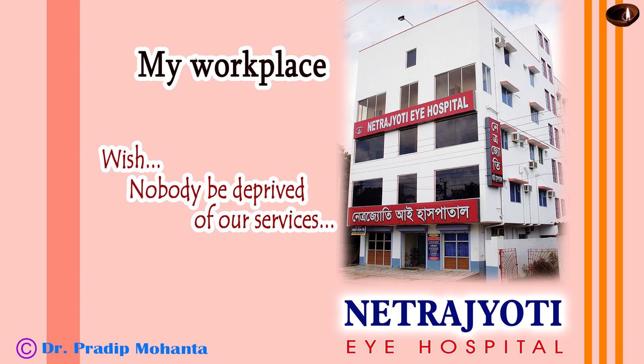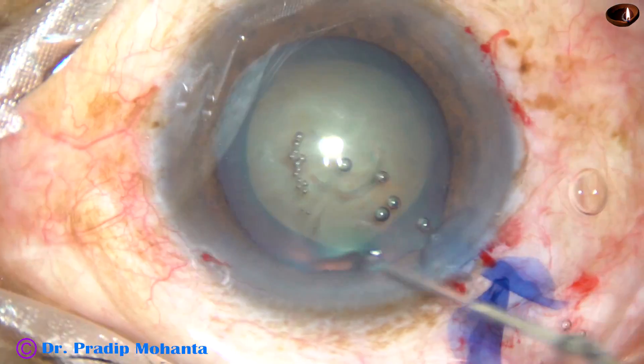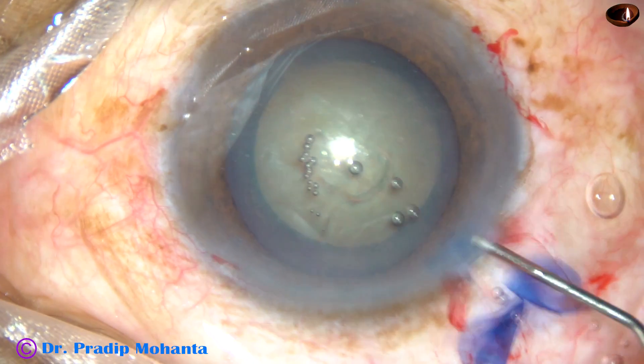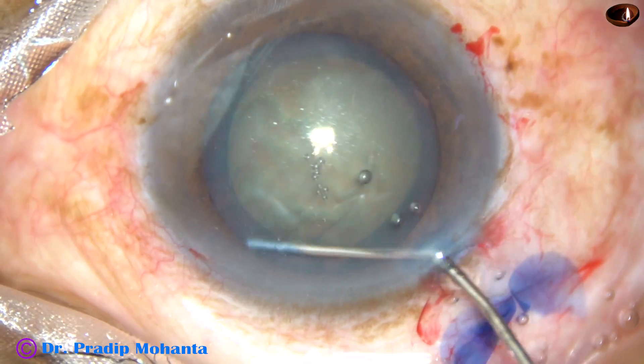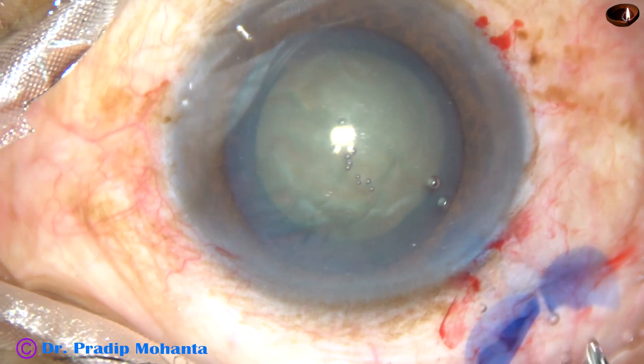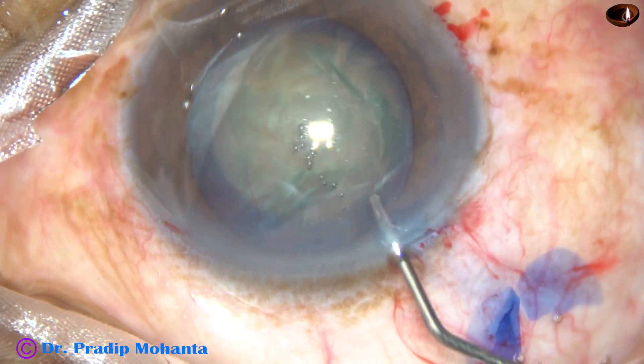Friends, welcome to my workplace at Rana Ghat, West Bengal, India. In this video, I want to demonstrate the divide and conquer technique of phacoemulsification. I have shown the technique in slow motion at 70% of real speed.